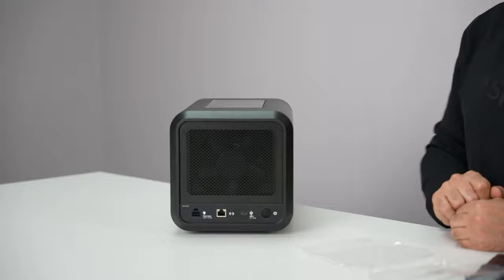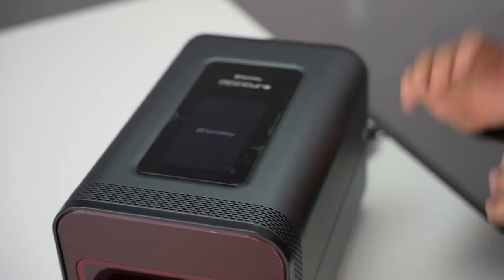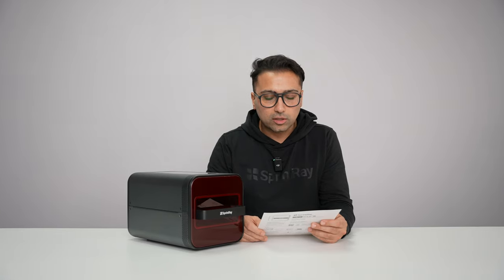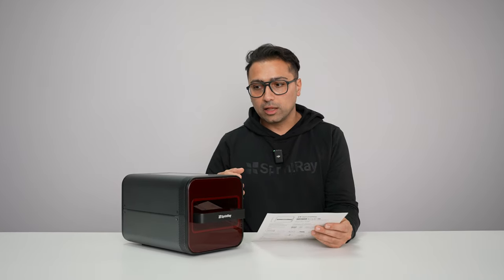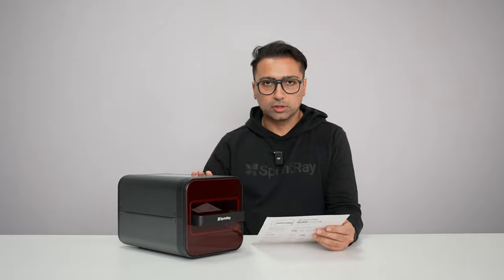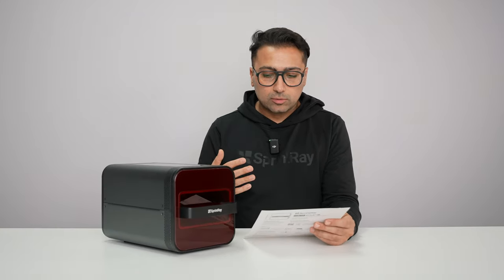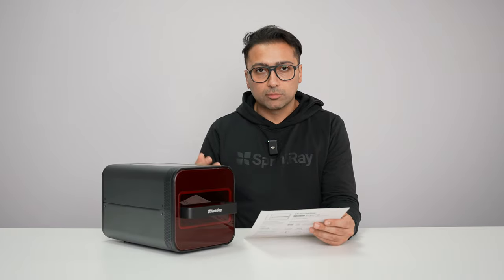And also the power button right here. Let's power this up. The system is powered on and booting up. Go to account.sprintray.com and create your account. This will help you connect your machine to your cloud account, which then helps you track and monitor the machine, as well as receive all the updates through that.